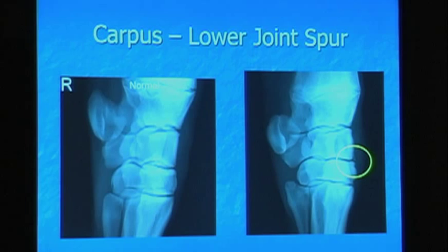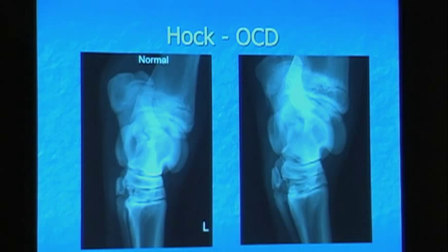Now we're on to the hock. This is a distal tibia. Here's the point of the hock or the calcaneus, this bone in here is the talus, central tarsal bone, third tarsal bone, and cannon bone, splint. On the left we have a normal hock and on the right we have a distal intermediate ridge of the tibia OCD. You see this is actually a fragment — it's a true OCD — and these do very well. This is the most common area to have OCD and they do very well with removal. The majority of them become clinical and are going to become clinical if they're not removed.